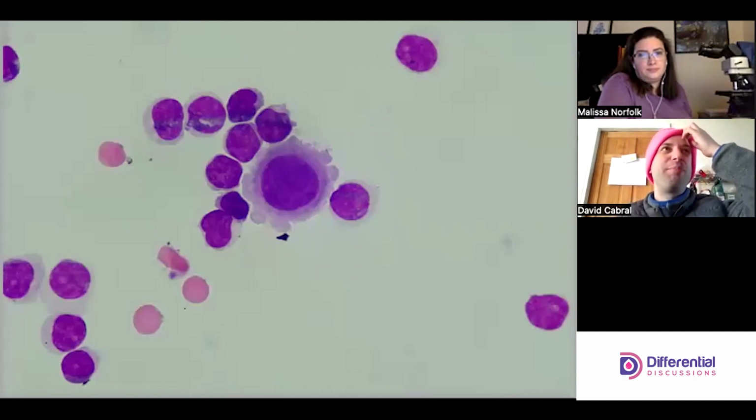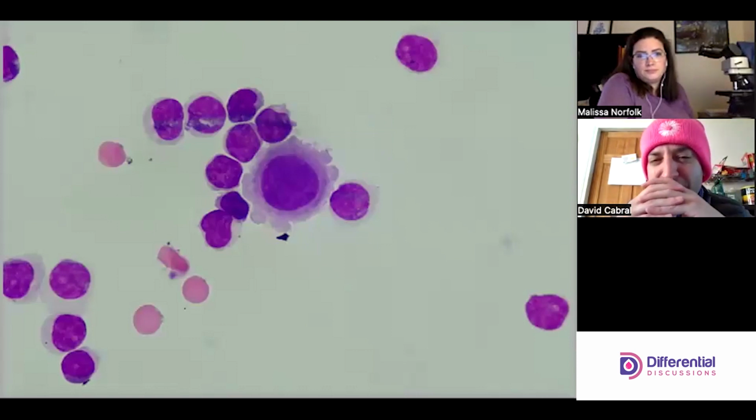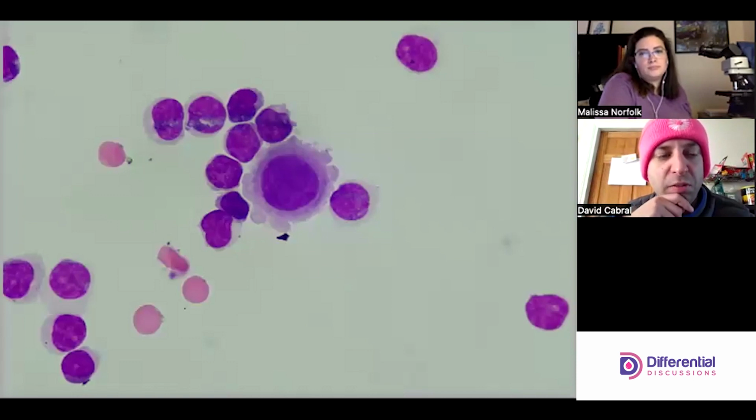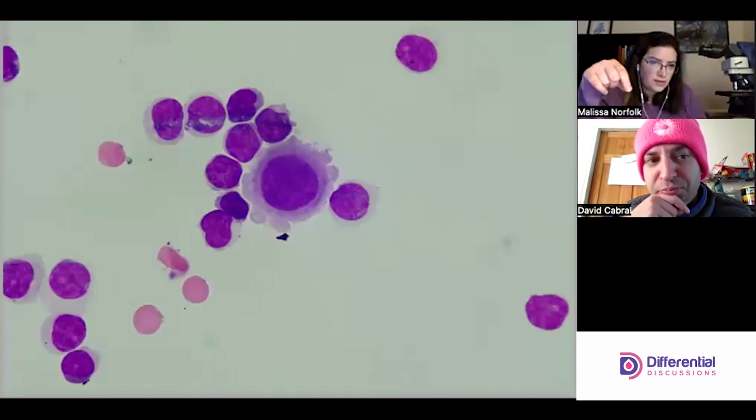This happens sometimes where maybe the nucleus is a bit big on a meso, but this has crossed a line, kind of. And especially since I saw those. So this is what I'll say. If this was the only cell I saw, I would be really looking hard for something else. Those blobs, perhaps. If I see the blobs first, I think I'd count this as the tumor other category for path. Yeah. Well, especially considering that other little meso that we saw.